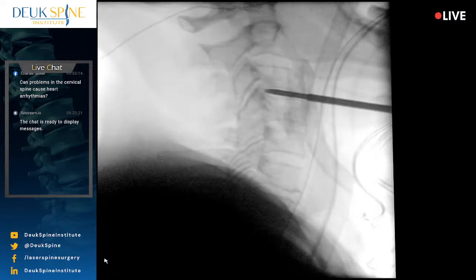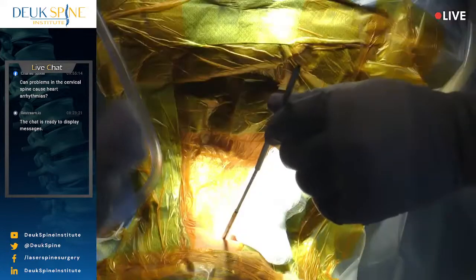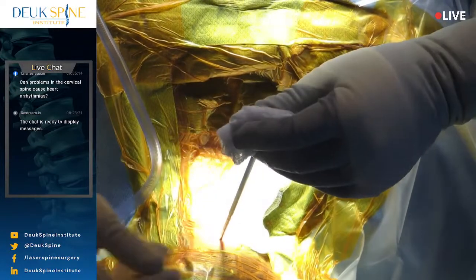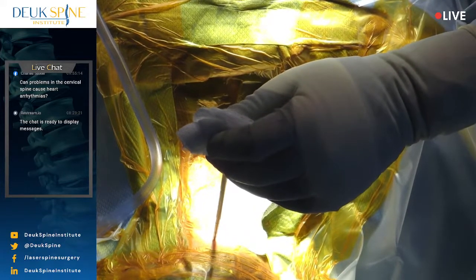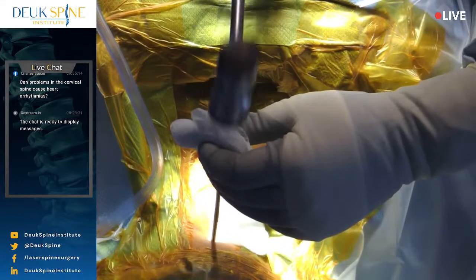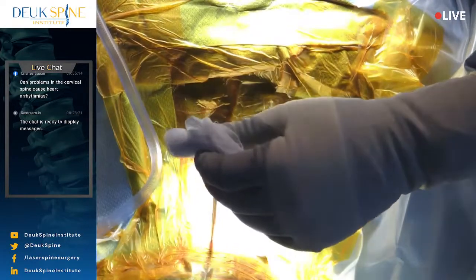All right, so we're approaching the front of the spine at this point, and now I have to advance this tube through the front of the disc to the back. Because the problem for all of these patients with neck pain, headaches, arm symptoms, it's always in the back of the disc. We discovered neck pain comes from the back of the disc. But arm symptoms have been known to come from the back of the disc. And what I was taught as a neurosurgeon was you do surgery to fix arm symptoms or spinal cord symptoms, but nobody ever understood how to get rid of neck pain.